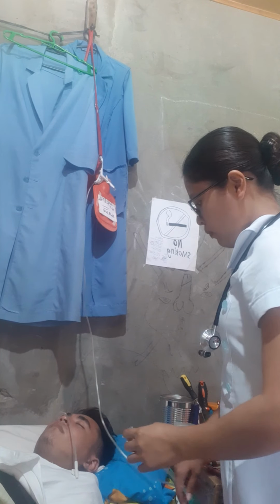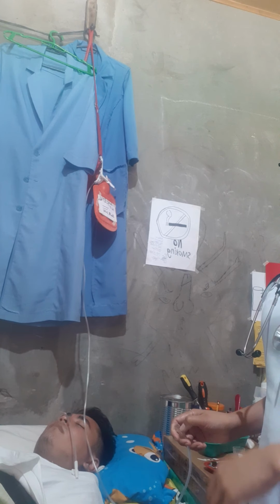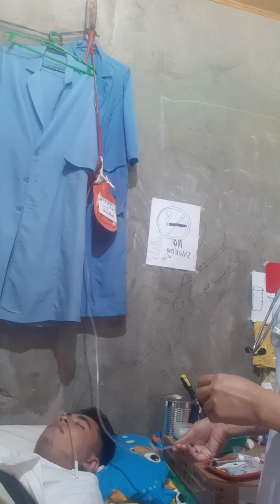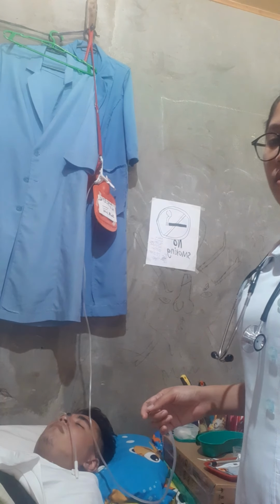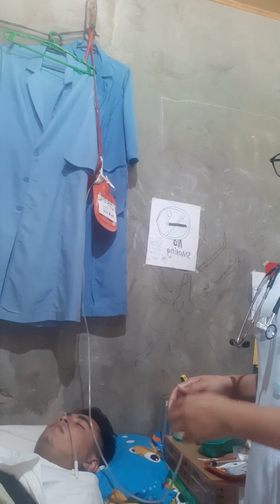Then we're going to attach the feeding set to the tube, then regulate to deliver the feeding over the desired length of time, or attach the feeding pump and follow the procedure. Then we're going to flush.